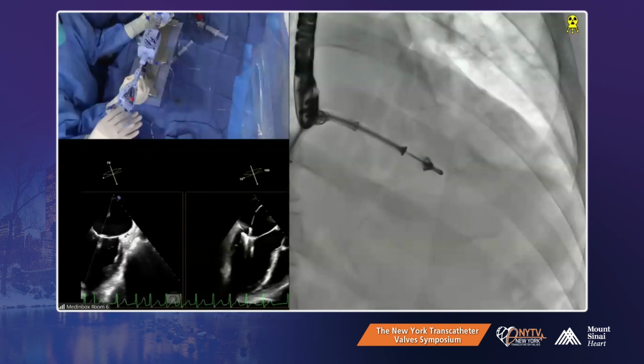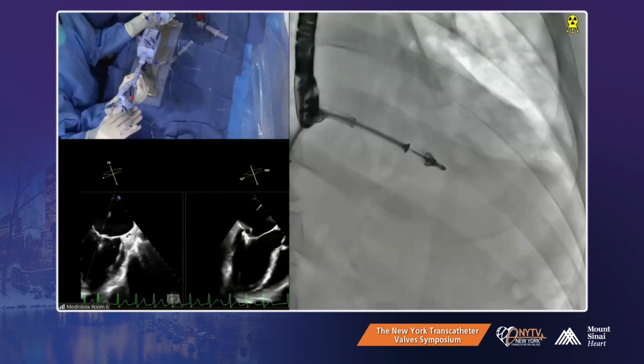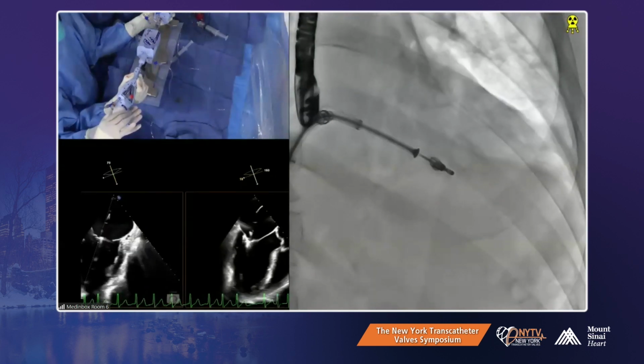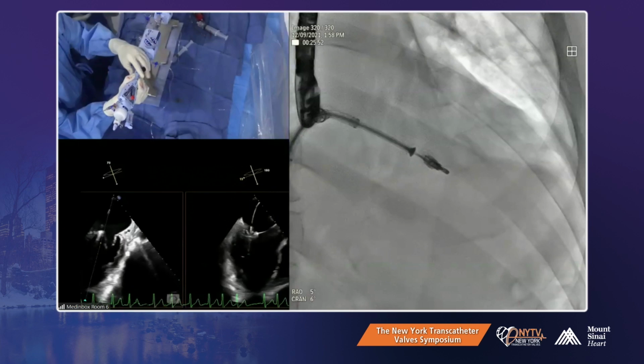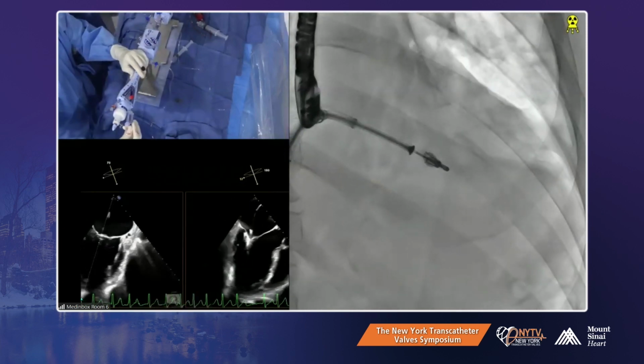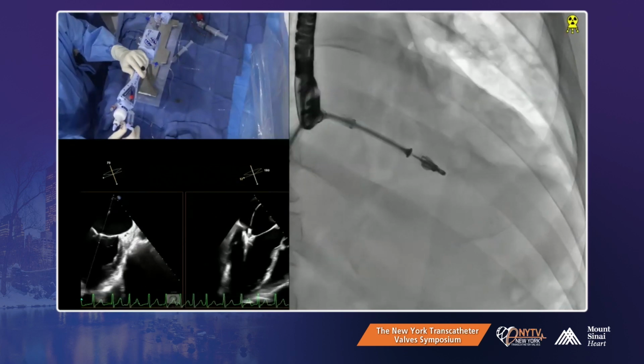Okay, let's see the color. Just close the clip a little bit and advance it so you take the tension off. Right. No, see, we didn't have it. We don't have it, see? Let me get the position's correction. It's already out. Was it tactile? It's latched. No, it's under.